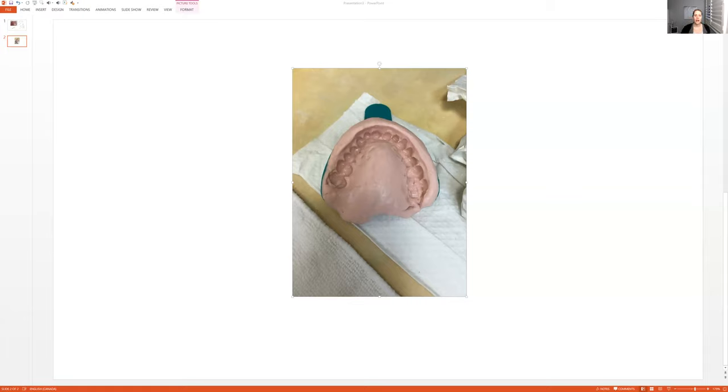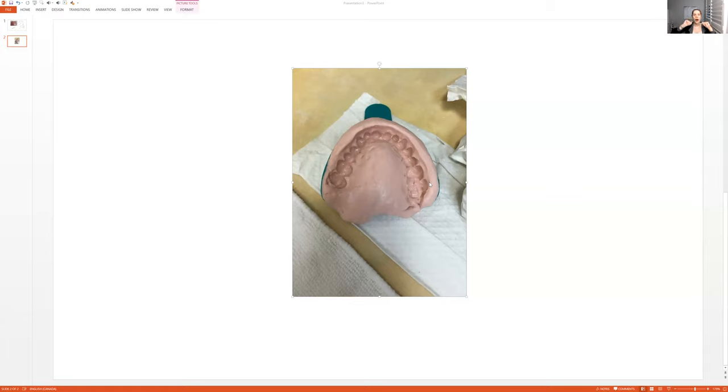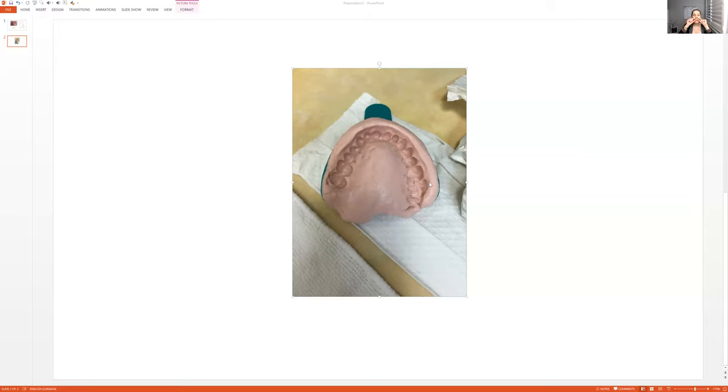That will help you to get this ring or that ledge around. So when you seat it, seat it high, because if it's not high enough, you won't be able to get all of the full tooth in there. Seat it, and then take your, I guess, forefinger and your thumb and move their top lip out like this.